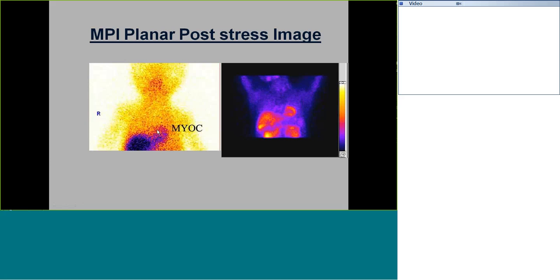Naturally, the logical question comes. Will there be a change in the myocardial perfusion pattern during this 1 to 2 hours? It will never be, because it's the still picture of the myocardial perfusion status at the time of injection, because no redistribution happens with technetium labeled sestamibi. But the myocardial perfusion status can significantly change after 10 minutes if you are doing a thallium study. So literally thallium imaging is not preferred in children, rather technetium labeled sestamibi is the imaging radiopharmaceutical of choice as far as children's myocardial perfusion imaging is concerned.